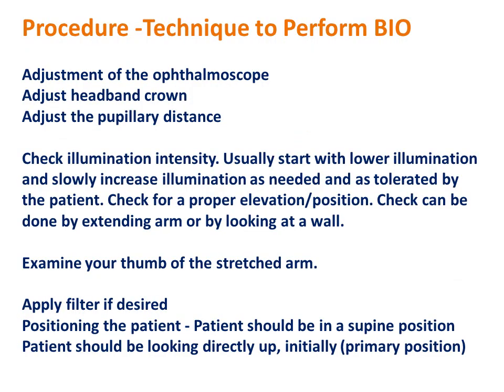Now we will go to the procedure as to how we should do binocular indirect ophthalmoscopy. First, you have to adjust the ophthalmoscope, keep the headband and adjust it in such a way that the headband fits properly and very firmly on your head. Next you have to adjust the interpupillary distance. You have an eyepiece for the right eye and an eyepiece for the left eye, which are movable. Once you move and keep in one position, they are steady in that particular position. So you bring it to your convenient interpupillary distance.